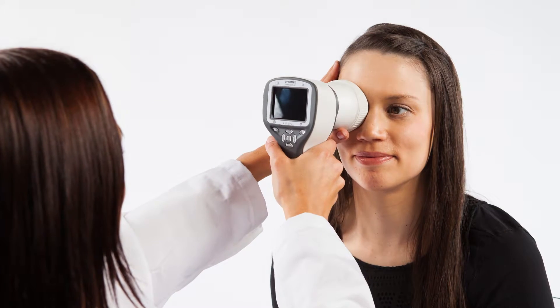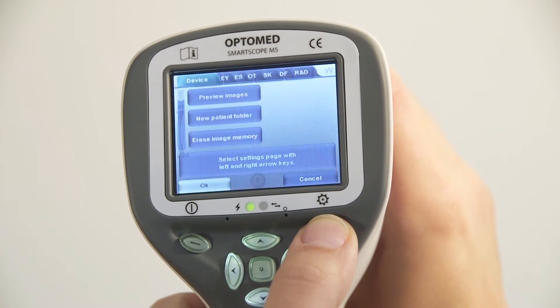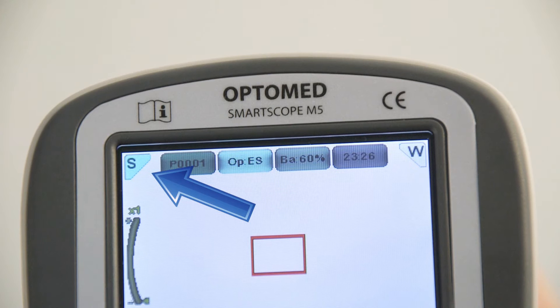Still or video capture mode is selected in the ES menu. To activate the menu, press and hold the right soft key. The icon on the top left corner of the screen indicates the selected mode.